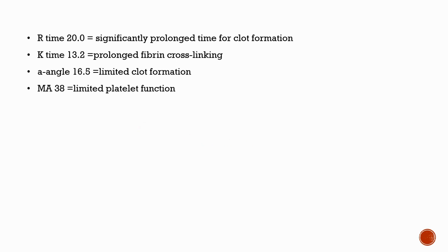Is there any specific order of which component should be transfused first and which component following? So we should transfuse platelet first, as we have seen in a cell-based model of coagulation that platelet act as a phospholipid surface for the coagulation factors to act. And so we should first transfuse platelets, then FFP and cryo.